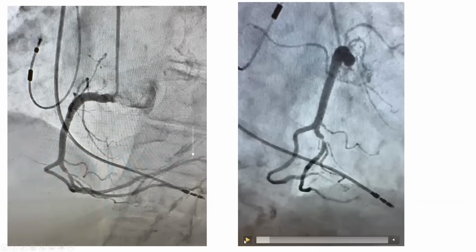It's important to know the anatomy. Why? Because this branch has a tight lesion. So one should know, should I fix it or not? If this is predominantly an acute marginal, we generally avoid fixing acute marginals. This is a special acute marginal.